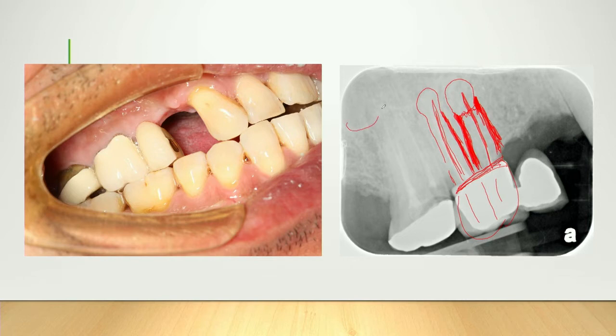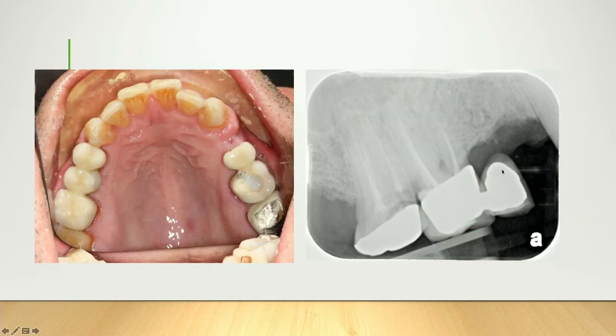You've got the sinus here to contend with. It's difficult to see. It's an upper, so just keep in the back of your mind, if you have a bulbous root, don't be fooled if the root is very mobile. Still keep drilling, especially around the end, just to get that bone undercut out of the way, and then you'll be able to take that tooth root out. So basically it's working root by root, trying to get the undercut of the bone away from interseptal and from mesial, and then that will allow a path of exit for your tooth.